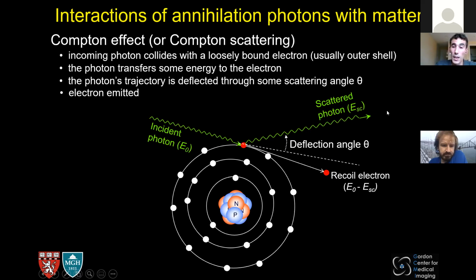So as you can imagine, Compton scattering is not something that we'd like to have in PETs because, if you had your annihilation here, you have the photon that is emitted. After scattering, this is what you're going to detect, okay? So the trajectory of this photon is actually not going through the site of annihilation, which is somewhere here, and therefore it's going to carry erroneous spatial information.